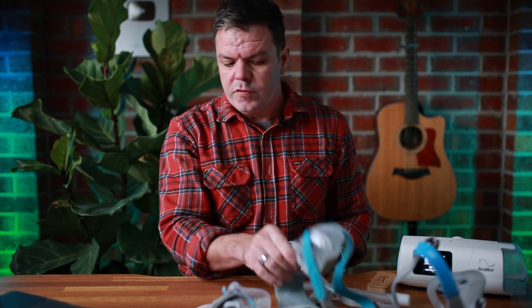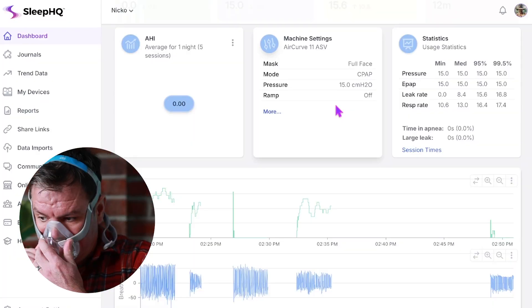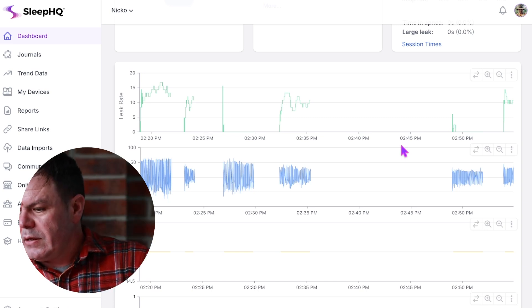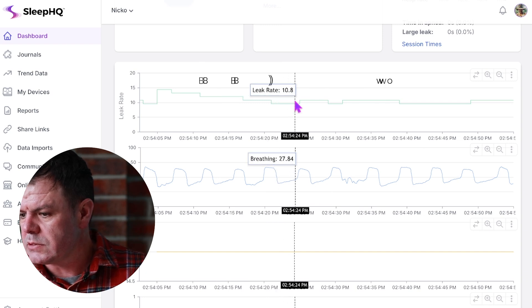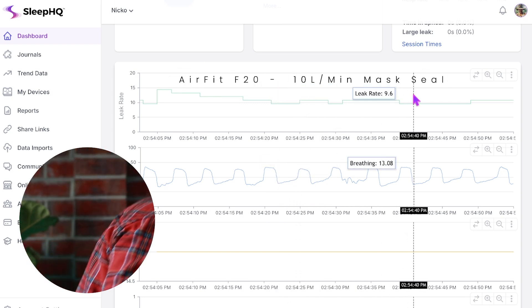We probably don't need to do the Evora Full because it was already on zero, so it's going to be zero again. But let's check out the F20. The F20 hasn't really improved much — still at 10 litres per minute.